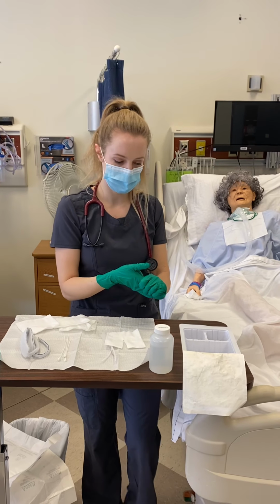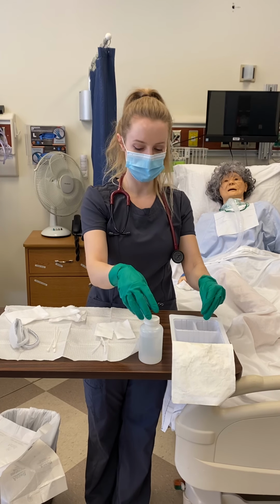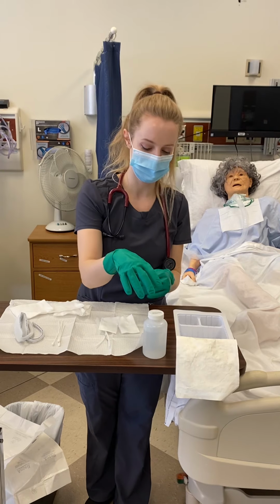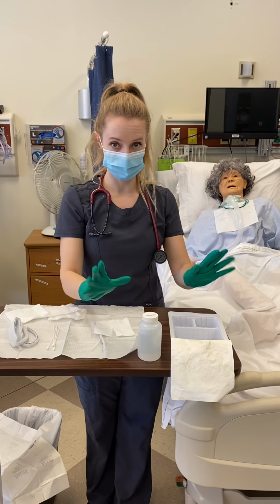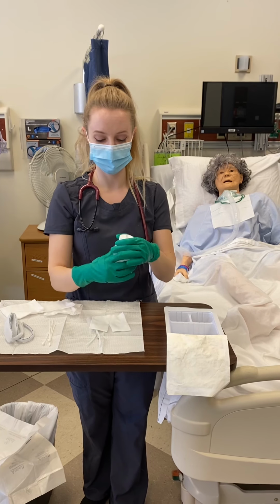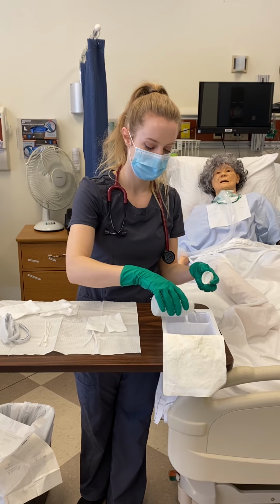I would normally have a sterile packet of saline in this container, and so for the sake of this video, I'm going to pretend that this is a sterile saline container that came from this kit and is sterile, so I would not be breaking sterility touching it. And I'll pour saline in 3 containers.